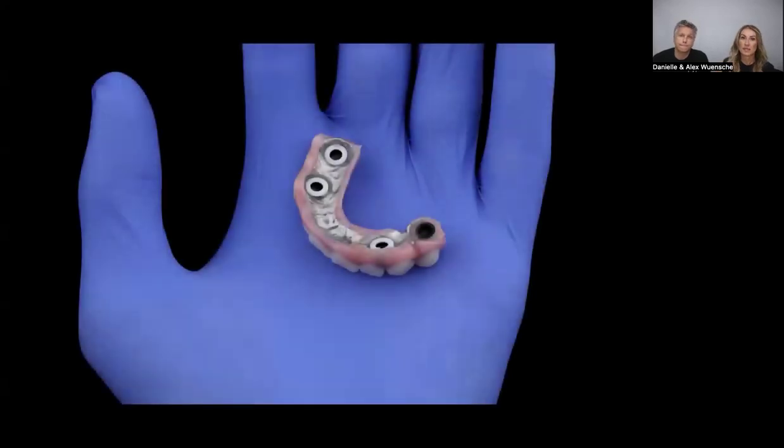And here you can basically see the locators picked up and the white rings, and how nicely this separated and came out of the patient's mouth. Cool is also, this is a very strong metal reinforcement. Because of vertical space, we decided to have a metal contact to the gingiva, picking up the housings. And you see the one housing already has the white ring already gone, so it most likely stays in the mouth and we can peel it out. And now we just have to clean it up basically and finish it.